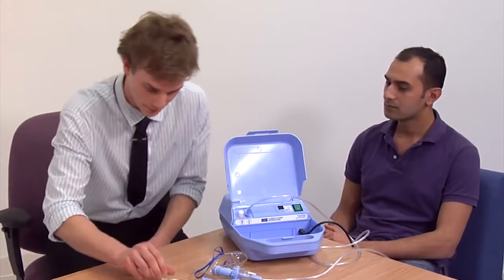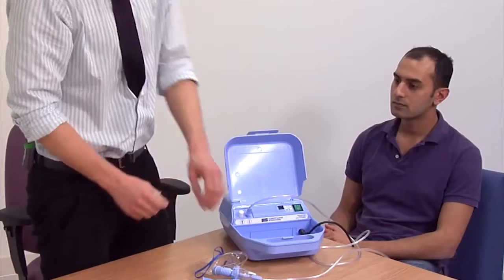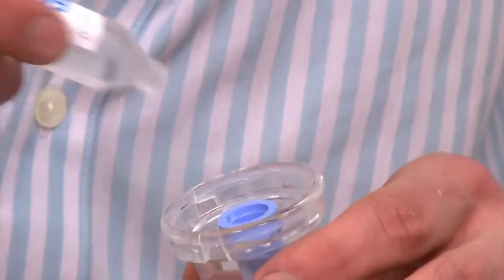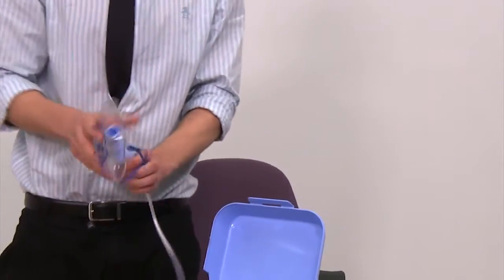Check the label and expiry date of the saline to be used. Then, open the nebuliser chamber and deposit the saline. Drugs, such as salbutamol, are also added in this way. Turn on the nebuliser and secure the mask in place.